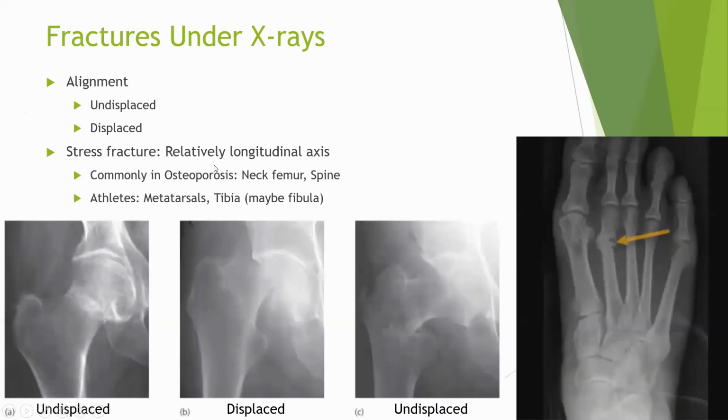All right, next, fractures. Under fractures, again, we are not talking about comminuted, avulsion, oblique, transverse fractures. Then there are so many other spiral fractures. We are not talking about that. This is not an orthopedics 101 class. We'll talk very briefly, as an overview, about what you usually come across in your hospital setting or clinic, outpatient department.